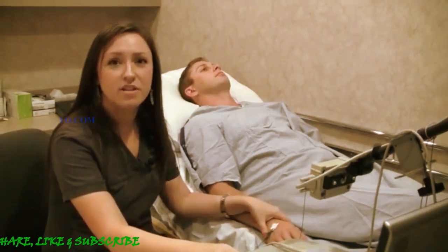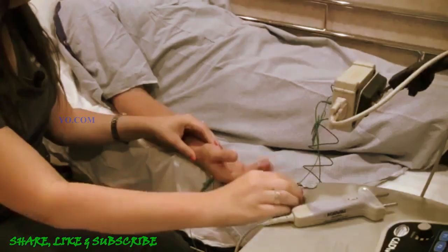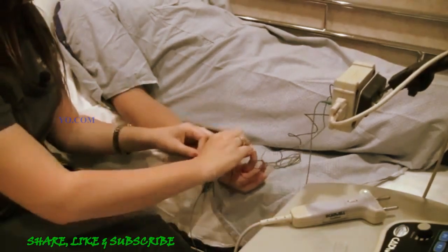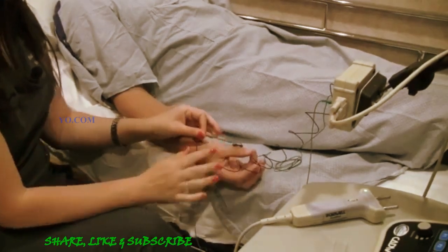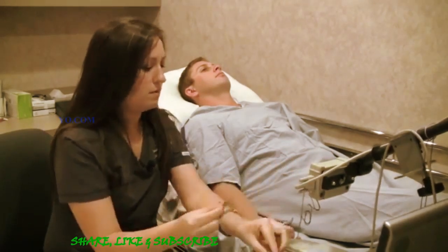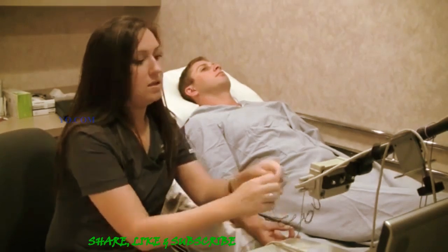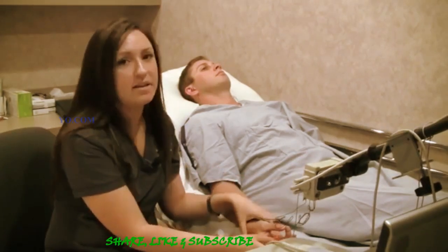So for the nerve conduction study, we place electrodes on your hand. We'll ask you to put your thumb and pinky together so that we can find your APB muscle and place an electrode on it. It's important during the nerve conduction study to try to remain as still and relaxed as possible.